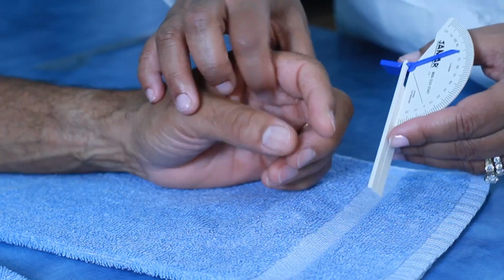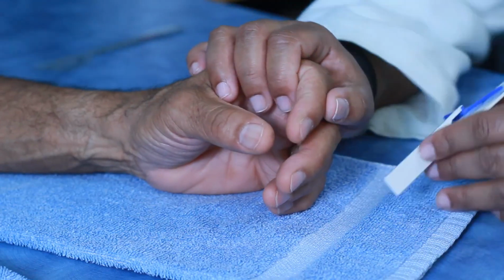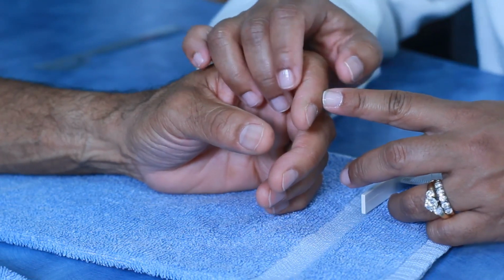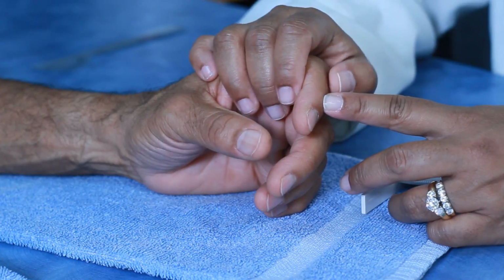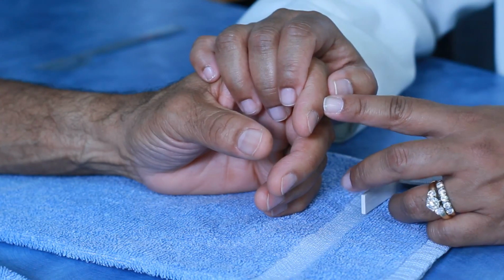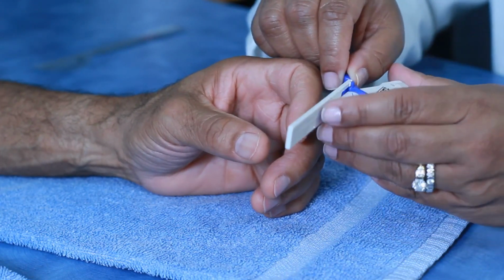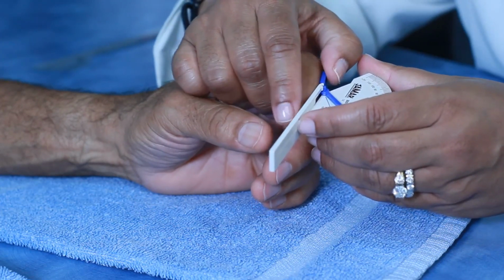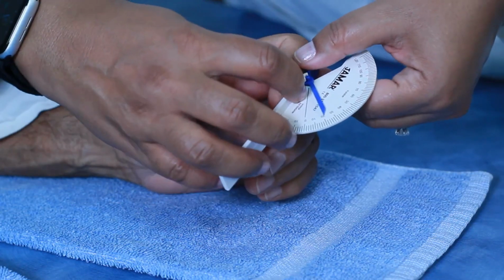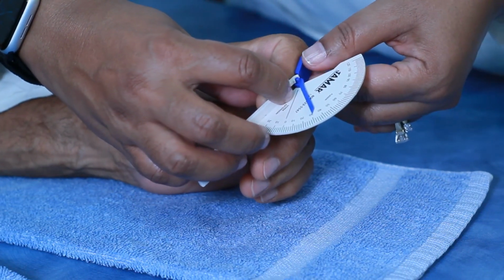All right, now we're going to move to the distal interphalangeal joint. When we measure the DIP joint, the fulcrum will be over the DIP, the proximal arm will be over the P2, the middle phalanx, and the distal arm over the distal phalanx. Here we recorded earlier 30 degrees. Let's make sure you can see this. There's the 30 degrees of DIP, and that's what that looks like.